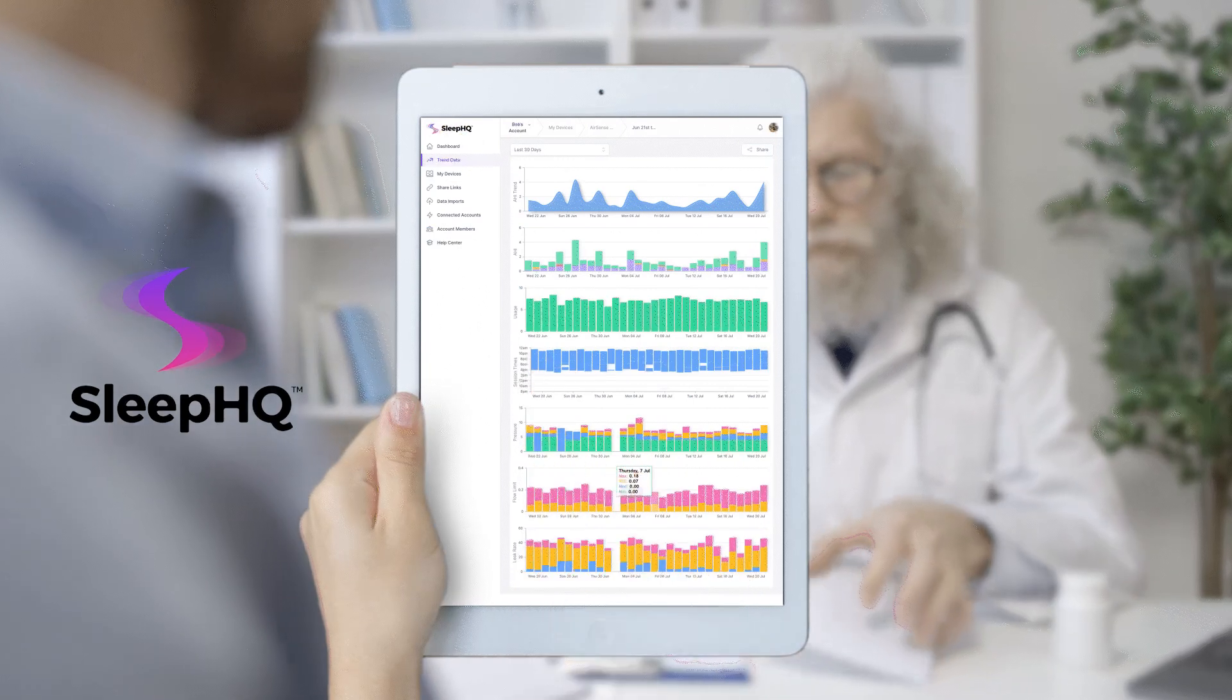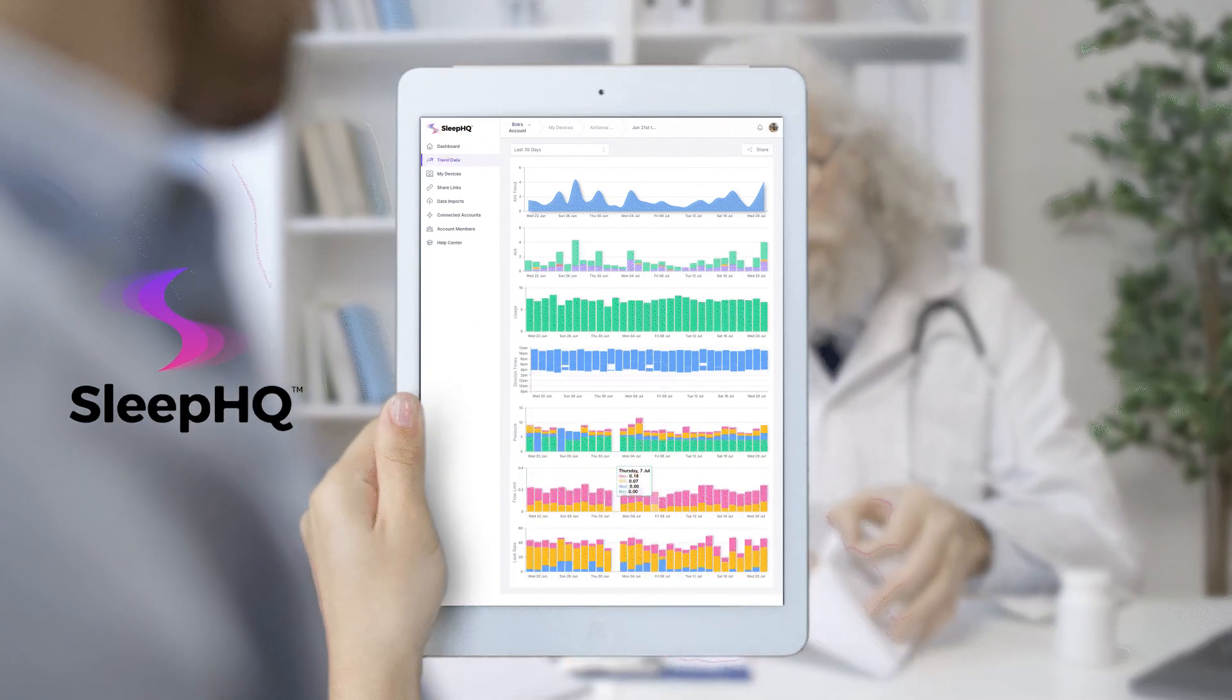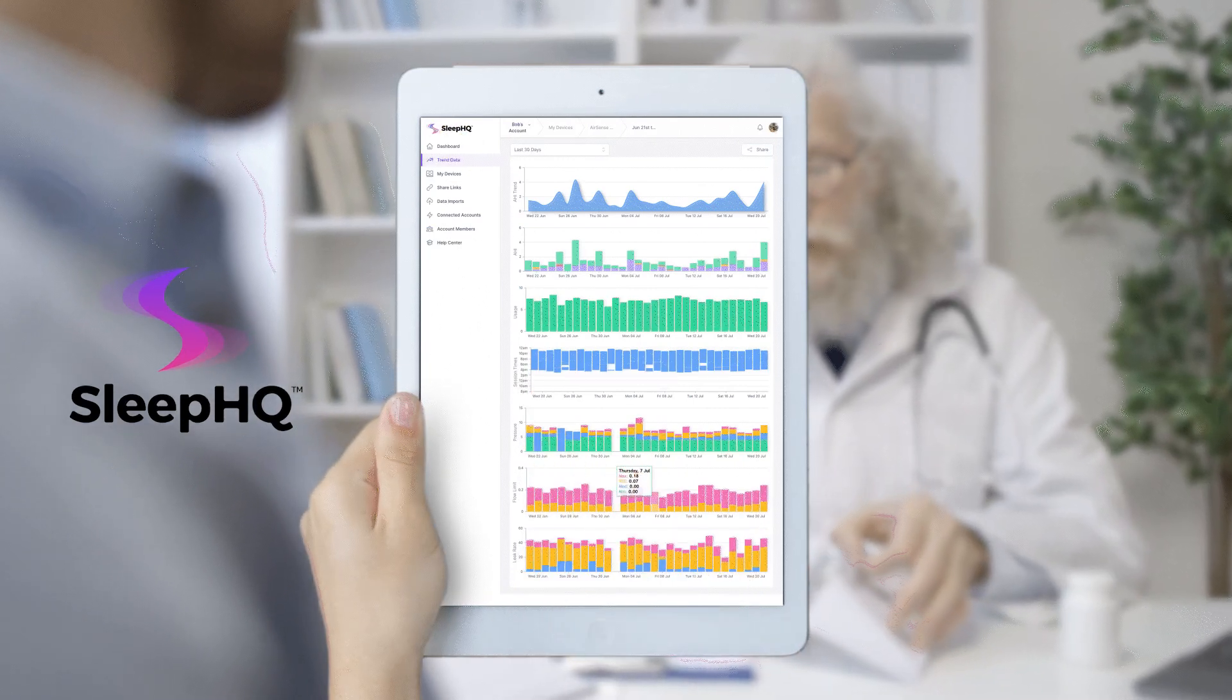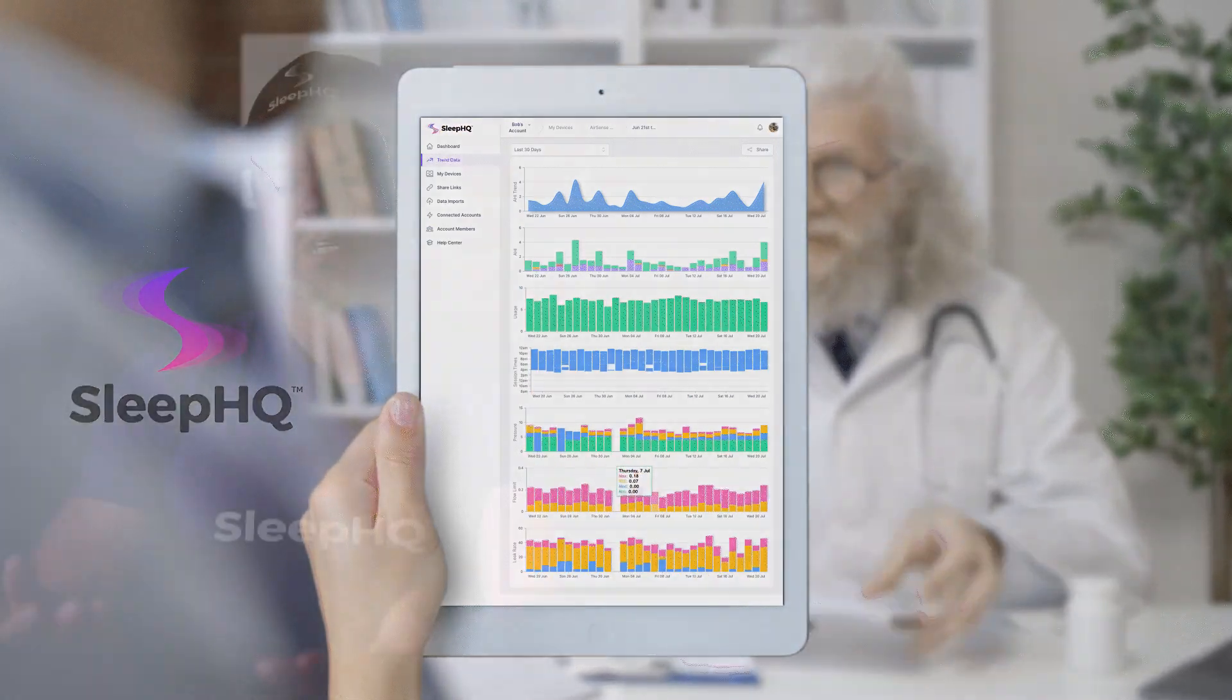First off, why would you use Sleep HQ? ResMed already has AirView. Well, there's a few reasons, but the big one is we provide remote access to full detailed high-resolution data, not just the summary data.